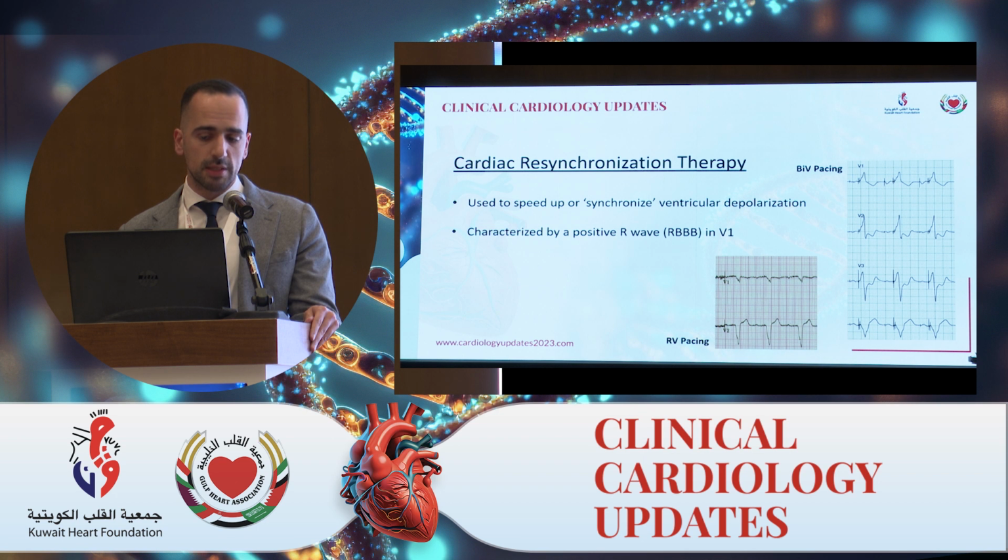They will lead to a dramatic change on surface ECG, namely in V1, where you will see the presence of an R wave, which indicates posterior ventricular depolarization, as opposed to traditional right ventricular pacing, where you will see a QS pattern in V1, kind of like a left bundle.